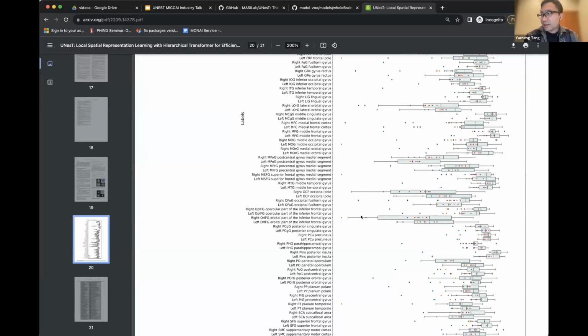We do try this, but we don't evaluate it yet. We have some brain images loaded into 3D Slicer, and it works on the segmentation of the human brain with a tumor, from the BraTS data, which has T1 weighted images.